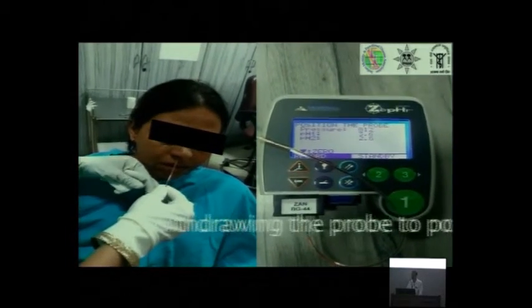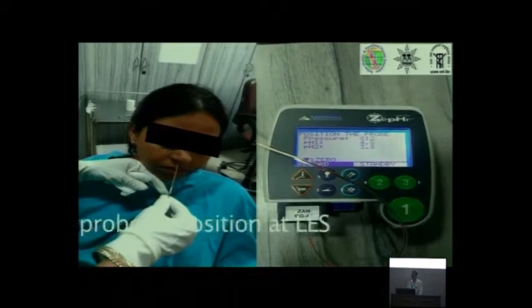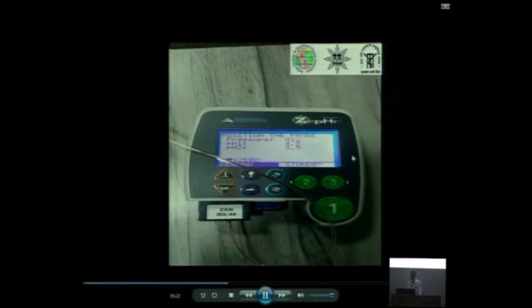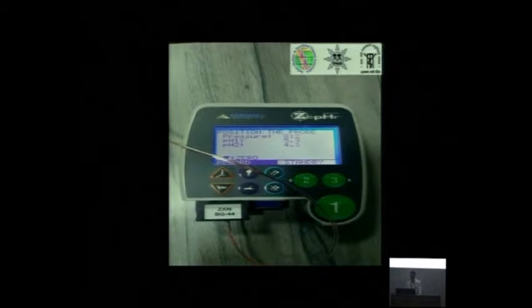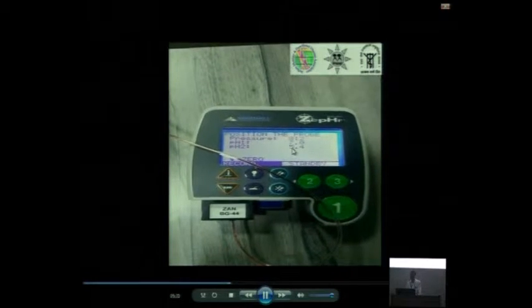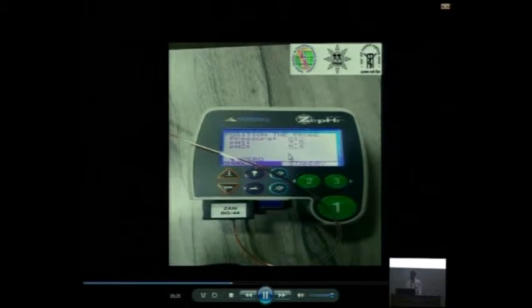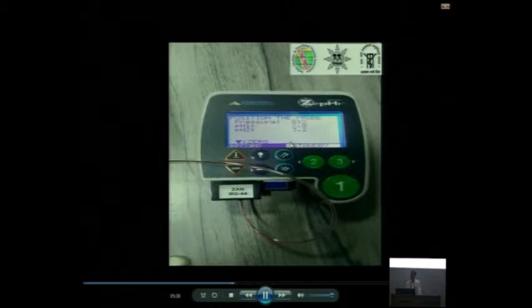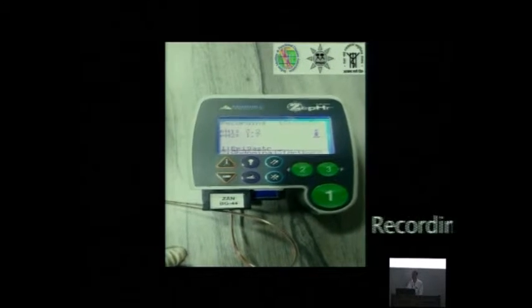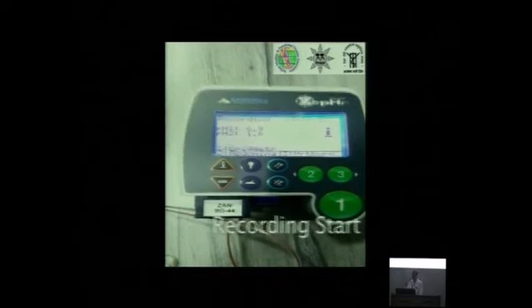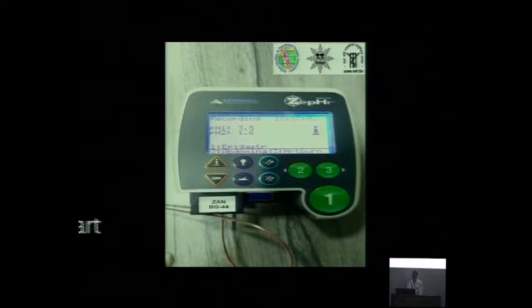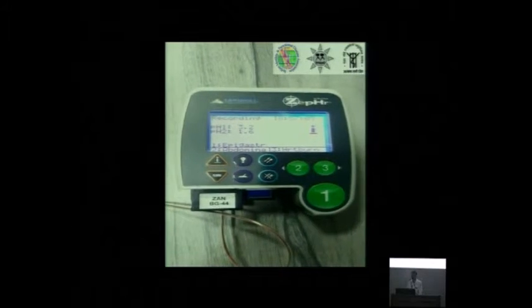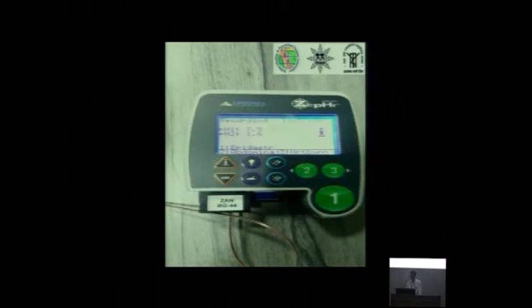Now then we withdraw the pH probe. You want the lower one to have pH of stomach and the upper one pH of esophagus. You are withdrawing. Look at this. Now the upper one is pH of esophagus. Upper one is pH of esophagus, lower one is pH of stomach. Now this is done. What you do is you also go by length. Don't go by only drift method, pH drift method. You do manometry before, you know the LES location, and you place the esophageal pH probe at least 5 cm above the LES.